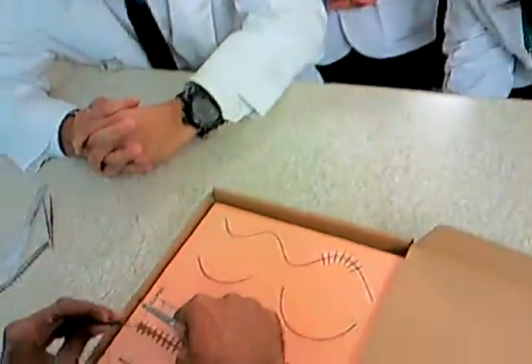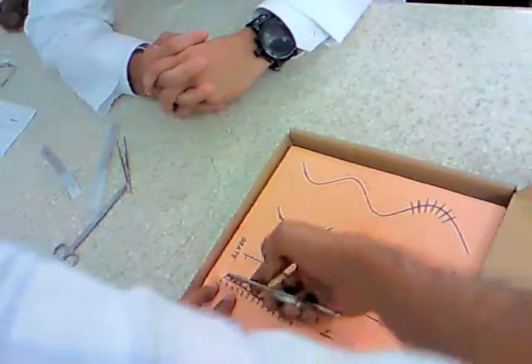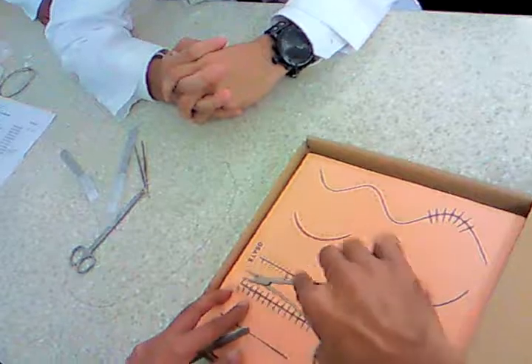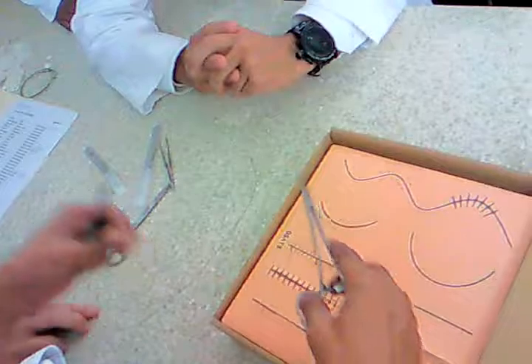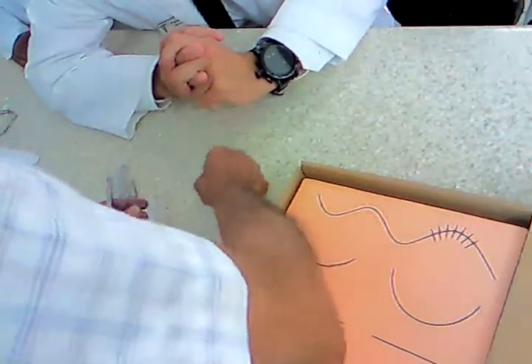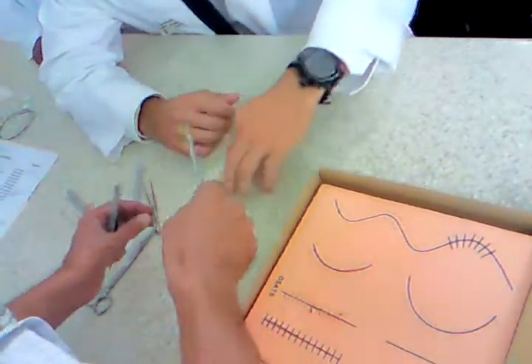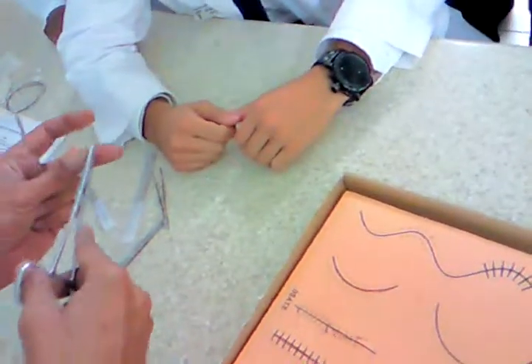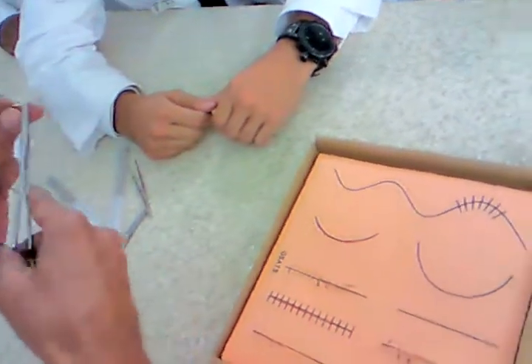So the first one, as usual. Okay. This is too small. I should have taken a bigger one. You need a sufficient length for this. Yes, you've got a delicate surgeon's hand. I've got a clumsy hand. That's why they say plastic surgery, cosmetic surgery, females are good at it because they've got very delicate fingers.